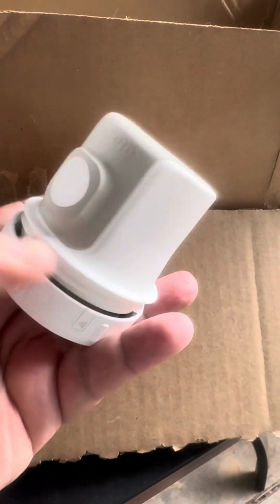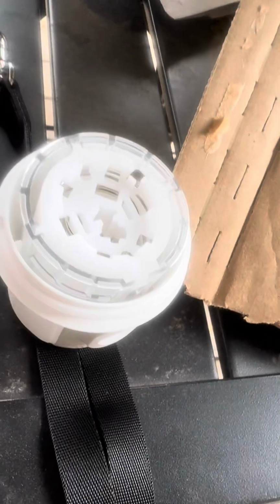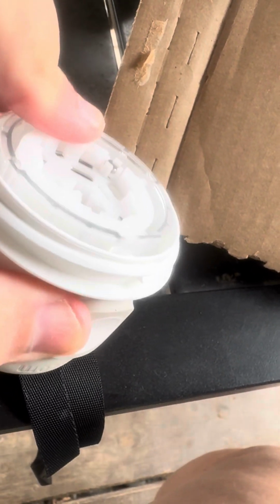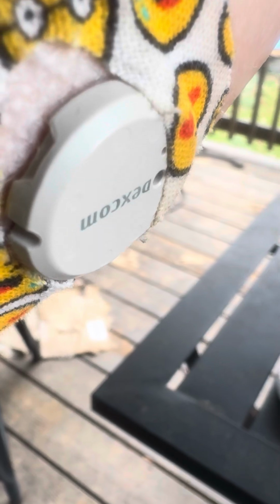This is what the actual part that injects into your arm does. This is the button you push to put it in. It's minus the sensor. This is the last one I just injected. You have to push enough to depress this safety ring into your arm. Then this ejects out of the middle, and this middle piece, the part that actually says Dexcom, goes in, and it's a little wire filament. It's not a needle that's very stern. It's just a filament wire, and it goes in, and it has a bandage around that part, and then you put an over bandage around it to help it stay on for the 10 to 12 days.